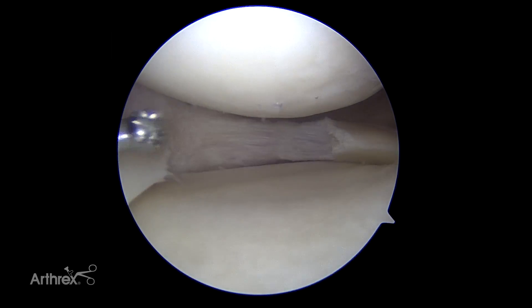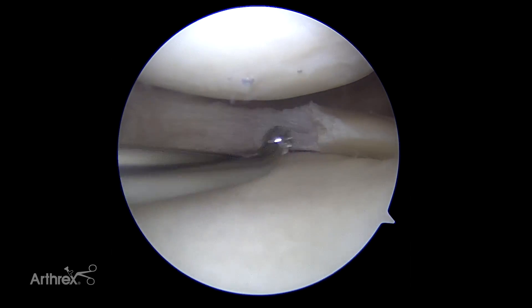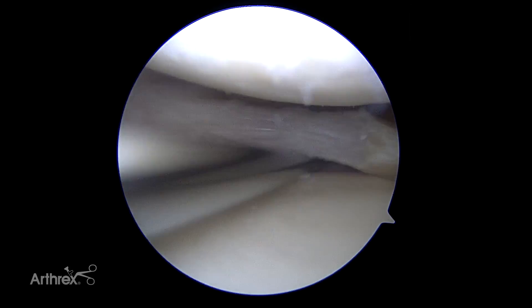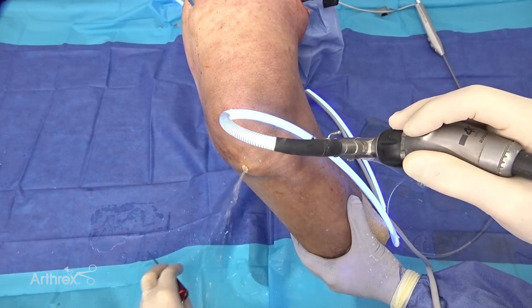Now I take my meniscal rasp and want to stimulate bleeding from the native capsular attachment here. This is where the blood flow to the meniscus comes from — the periphery. So I'll go here a little bit underneath the capsule to help enhance the healing.